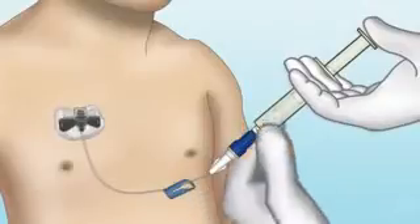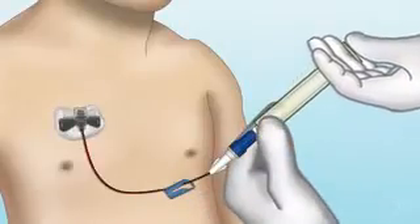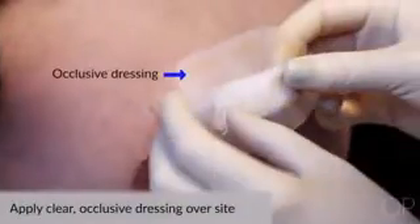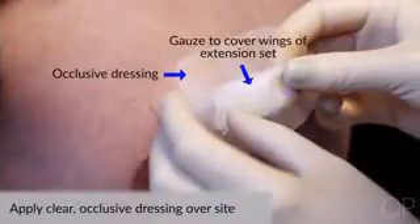Gently flush with 3-10 mLs of normal saline or aspirate for blood return to verify proper placement. Apply an occlusive dressing. If necessary, cover the wings of the extension set with a folded 2x2 gauze to prevent inadvertent removal of the needle when taking off the occlusive dressing.